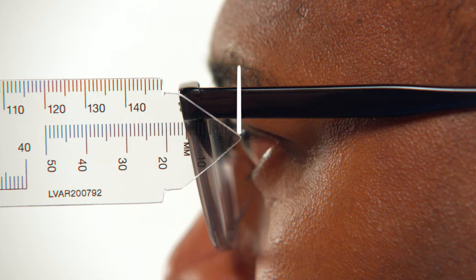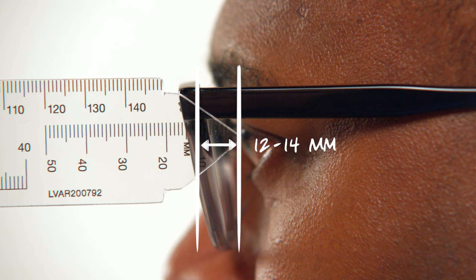Optimally, the frame should be adjusted so that the vertex distance measures between 12 and 14 millimeters. In this case, the vertex distance is 12 millimeters. Thank you, Marvin.